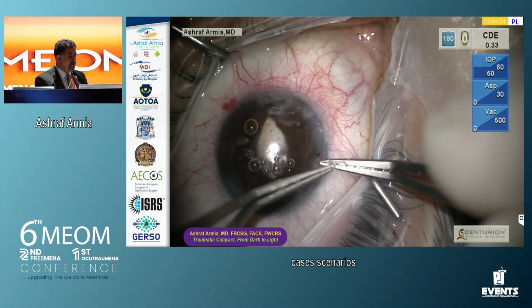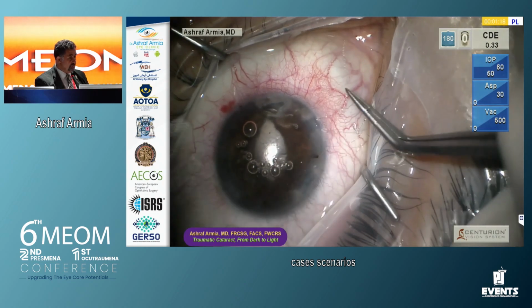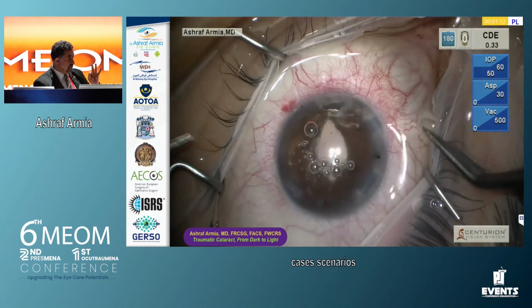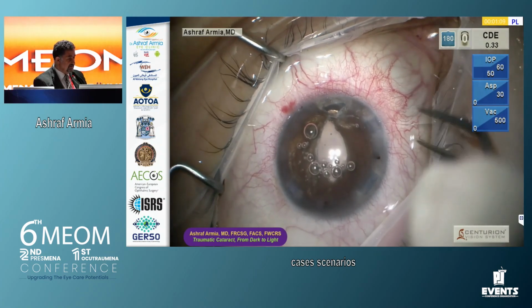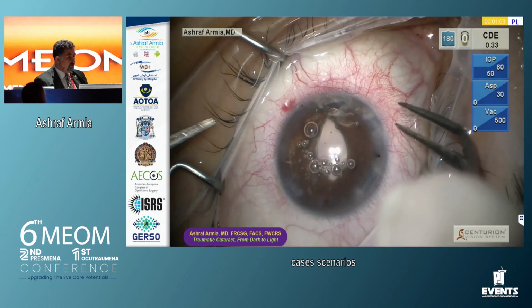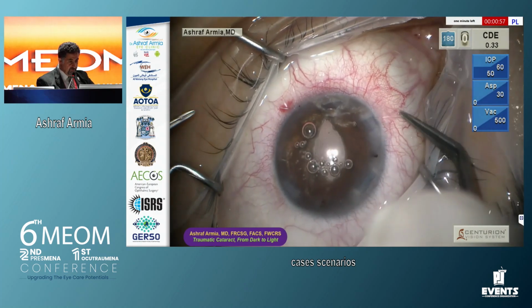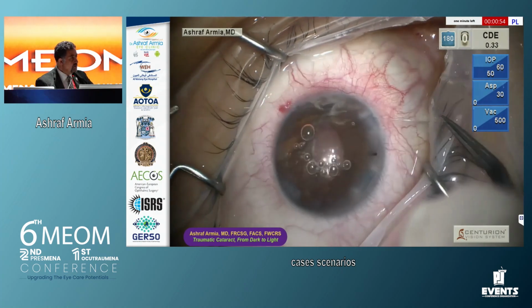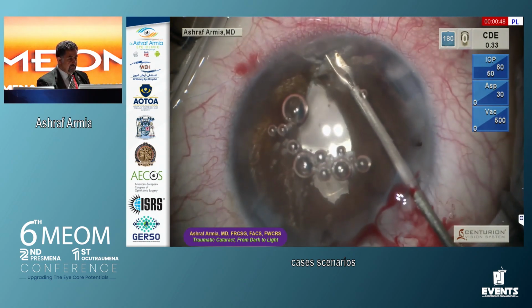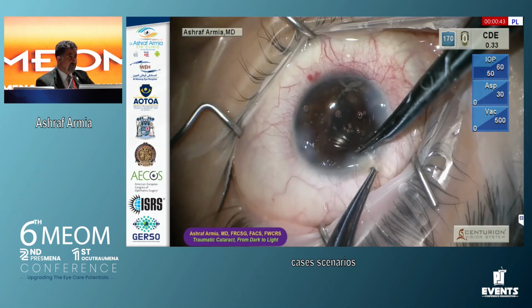So you are not going to complicate your case. This is the most important: never complicate your case. Take 1, 2, 3 sutures till you restore the pupil as much as you can. Sometimes you cannot reach a rounded pupil in these cases, but if you are closing as much as you can, you can reach an appropriate shape of the pupil. So again, 4-throw pupilloplasty, 1 knot, 1, 2, 3, 4, and you slide the knot, done like this. Again, Amar changed the way for iris repair suture. This is in my opinion, and it makes repair very fast.